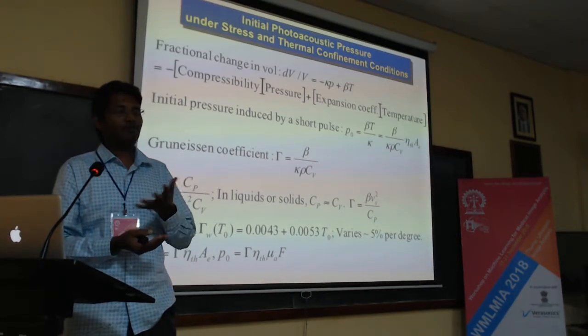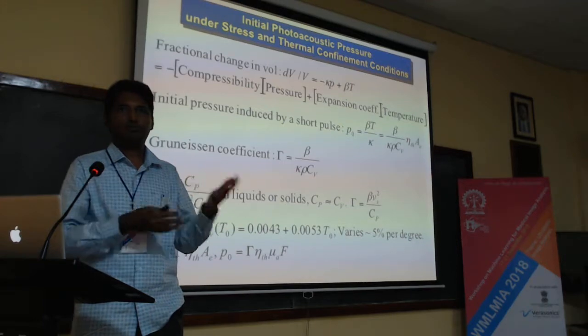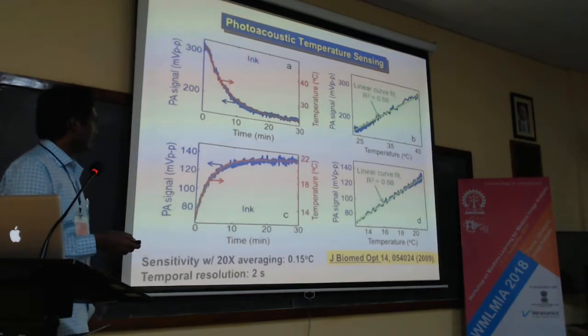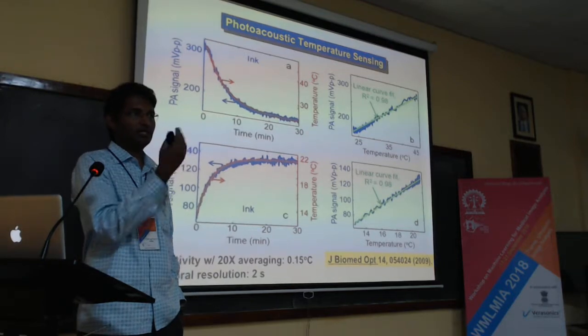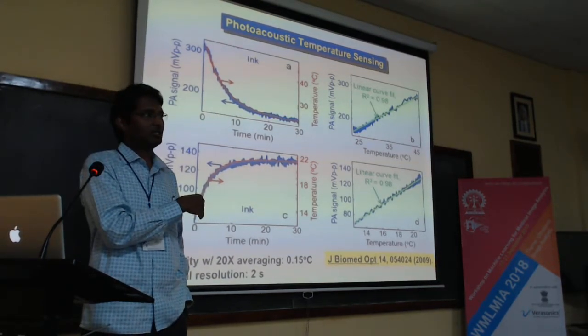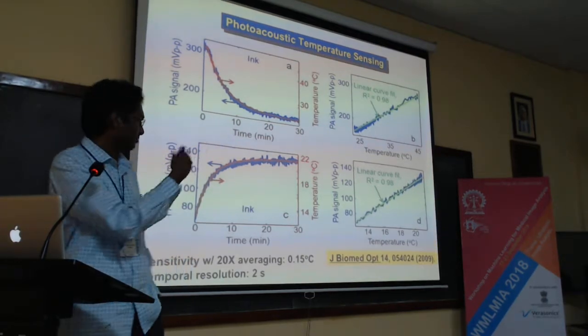Depending on the stiffness of the tissue, your initial pressure rise is going to change quite a bit. So it is similar to ultrasound. Now, you can also turn around and use this technology to sense the temperature, because the initial pressure rise is directly dependent on the temperature. So if I can reconstruct the initial pressure, I can also go back and sense what the temperature of the tissue is. That is something you could do.